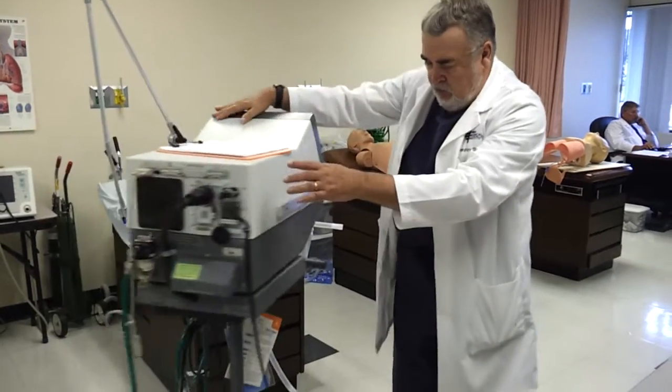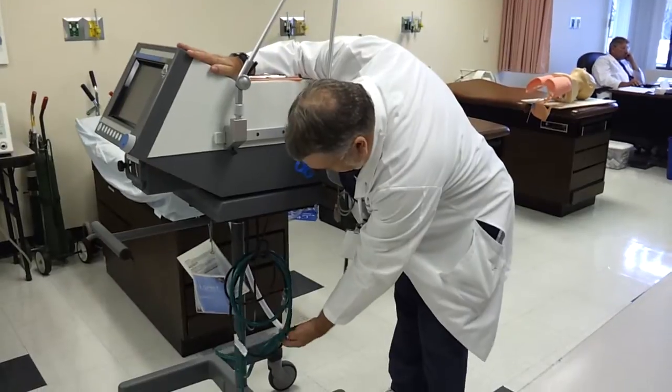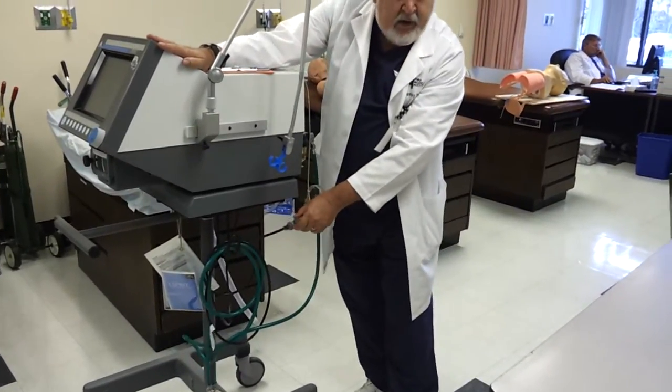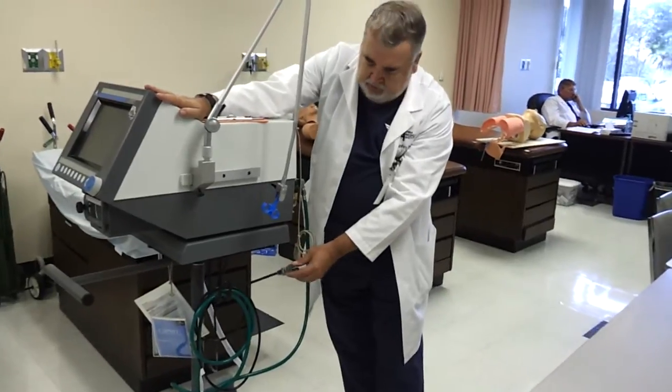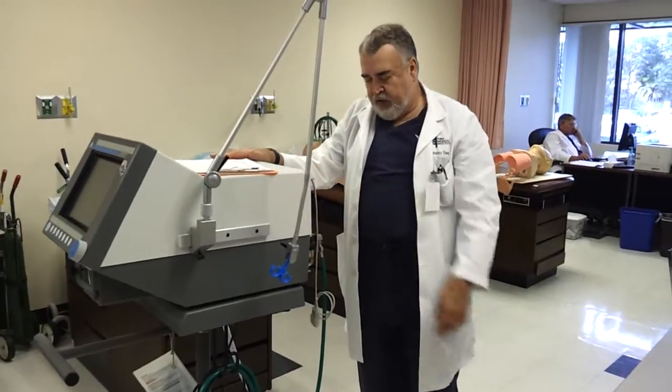Also, you have your power source. The Esprit runs on electric, so you have an electric plug. You would plug that into a red plate electrical outlet at the hospital, so you'd know that it was with the backup generator.